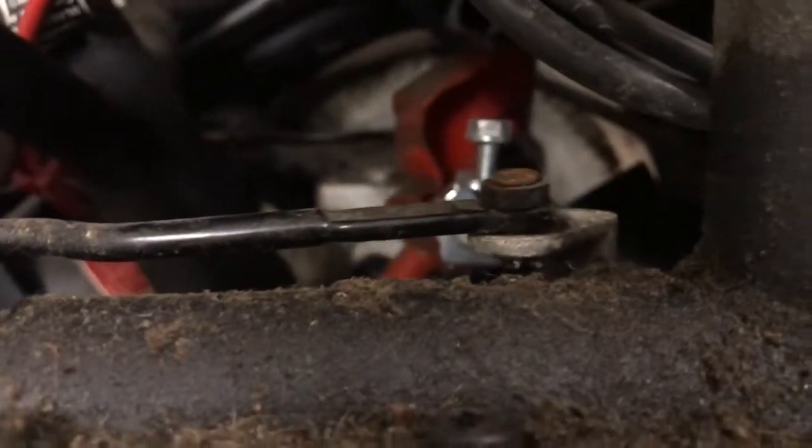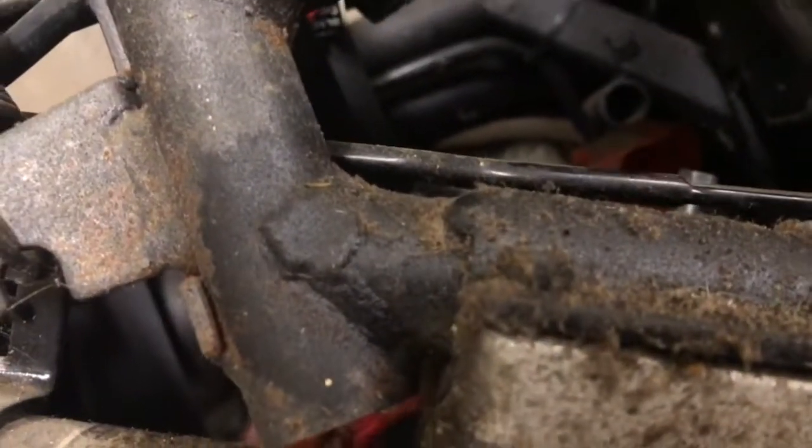And you may have to keep constantly messing with this brake lever, because you're going to have to be doing anything possible to get your angle right, trying to get this little lever off. They're usually not this short. Somebody cut this one short. Okay. You can kind of see it. Both of them right there. All you have to do is straighten them out, and you'll be able to pull it with some needle nose.